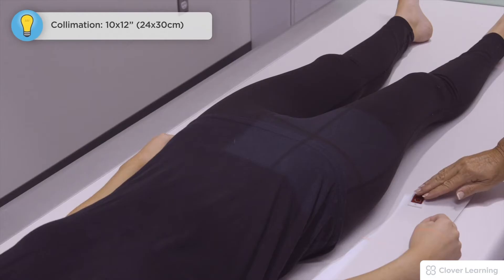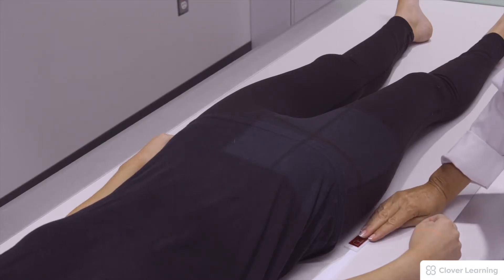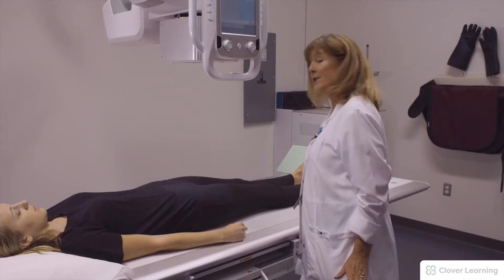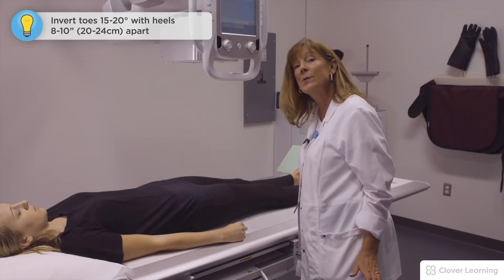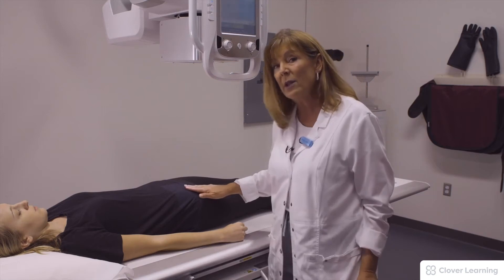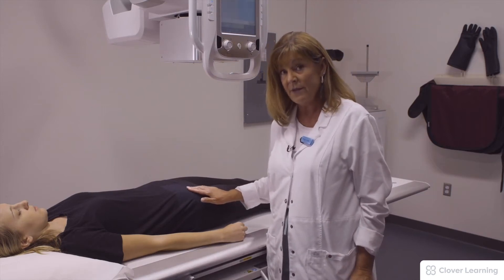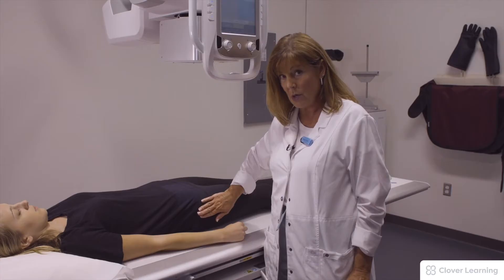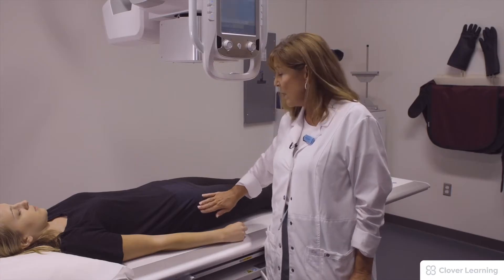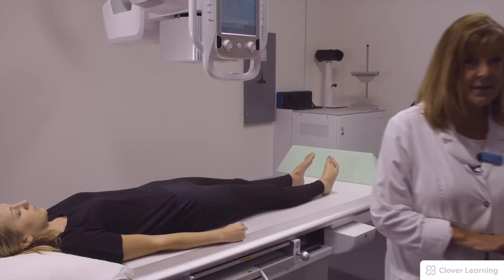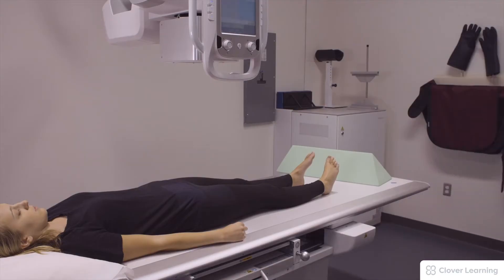We're going to place a right marker here on the side. We want to invert her toe 15 to 20 degrees with her heels 8 to 10 inches apart. That will help elongate the neck of the femur and put that greater trochanter in profile. We want to suspend respiration, hold the patient really still, and then the exposure is made.